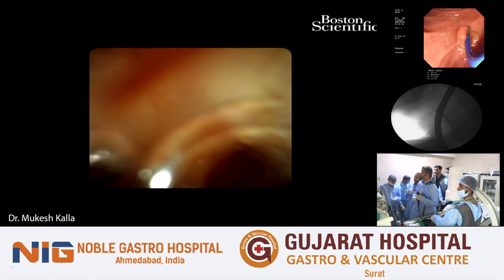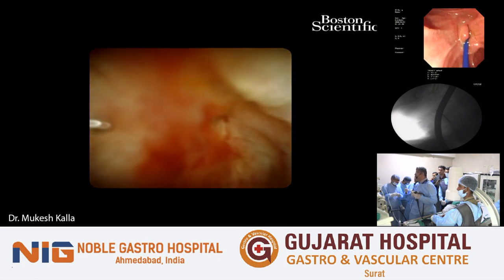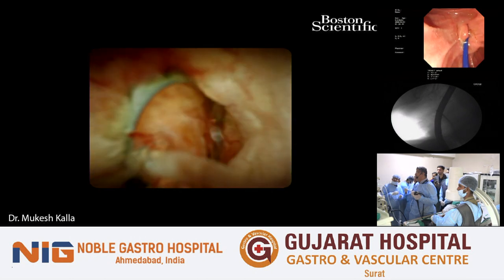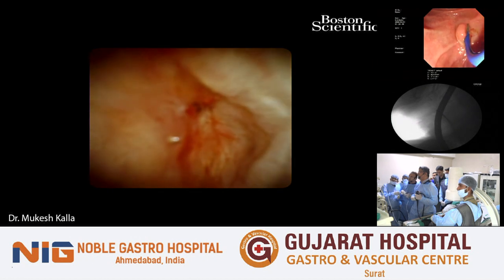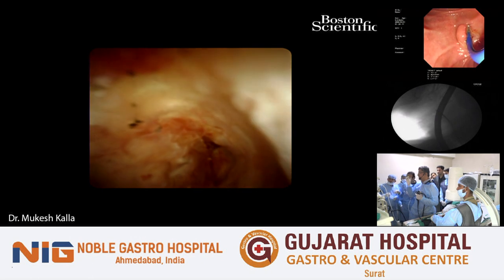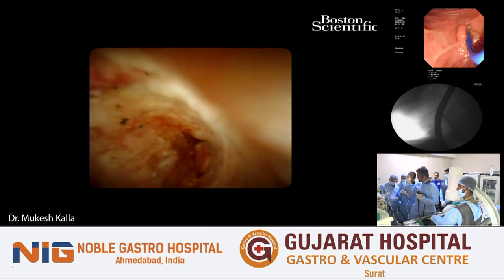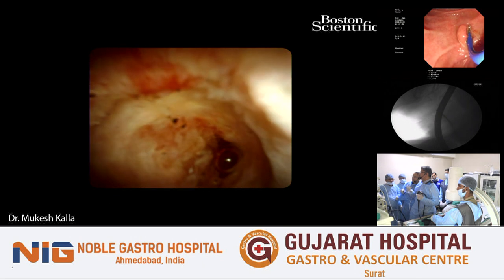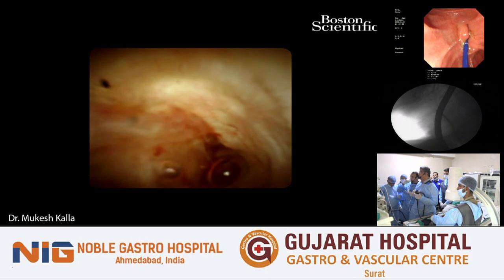Okay. So my question is, have you come across an impacted CBD stone that is stuck to the mucosa? This is a floating stone, but what if it is impacted at the mucosa? Impacted stone, you mean a large stone? Adherent to the CBD mucosa. Oh, you mean a kind of diverticulum in which the stone sits? Correct. It should not be a problem if you are using a cholangioscope, because everything is in your vision. Very good.